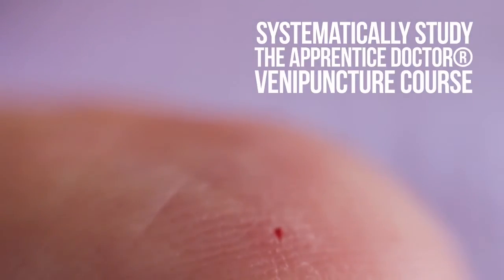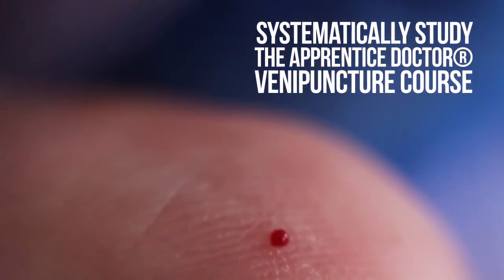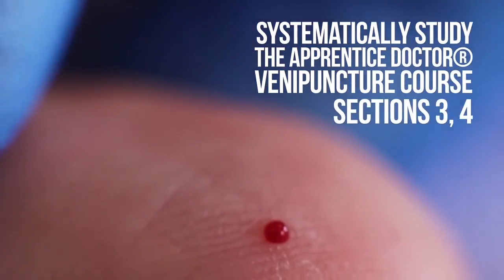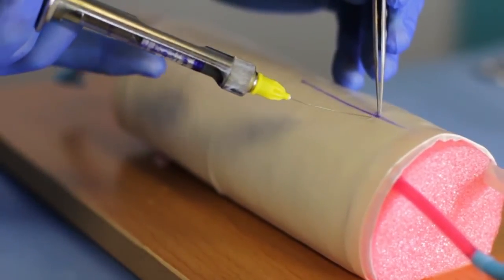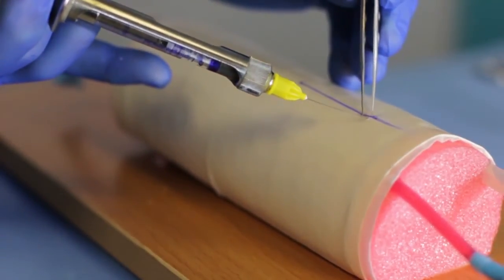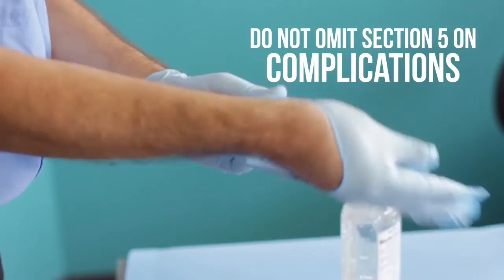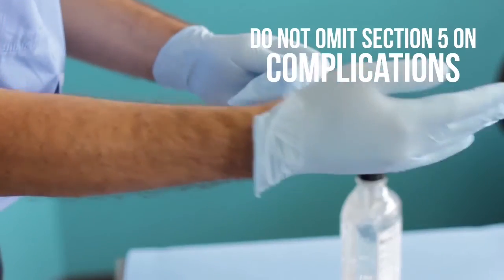Systematically study the Apprentice Doctor Venipuncture course sections 3, 4, and 5 in order and perform all of the practical projects using your Venipuncture trainer. Where applicable, do not omit Section 5 on complications.